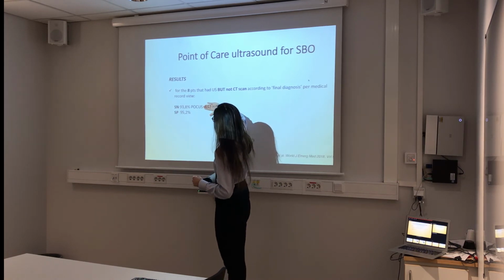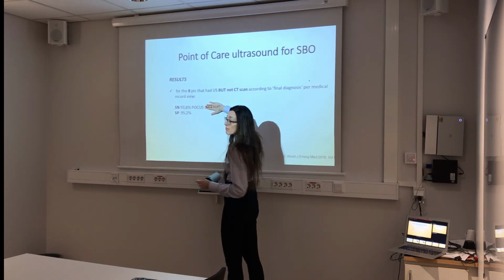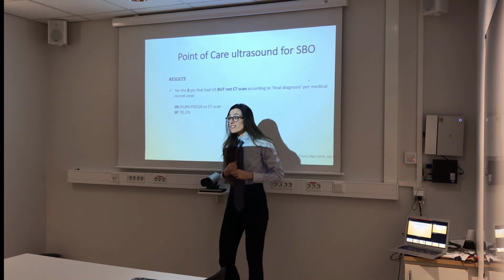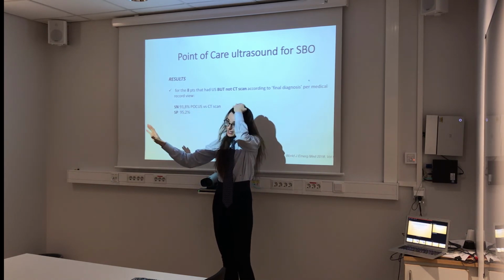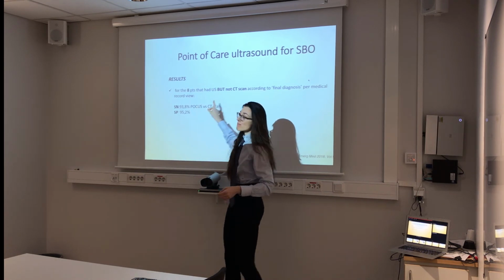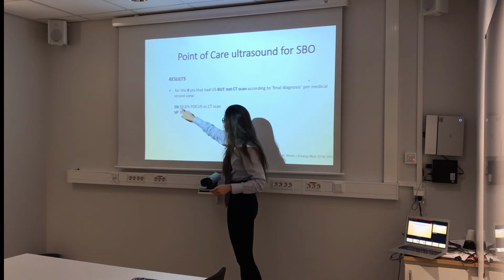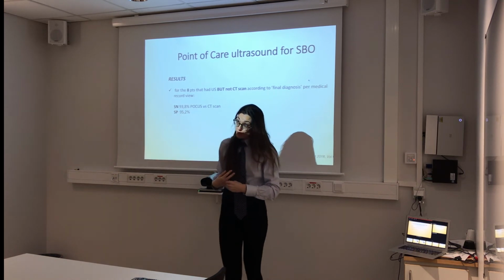This is wrong, it's not versus. The number was almost the same, so they didn't have the CT scan, but for diagnosis, the sensitivity was almost similar, and the specificity was even higher. Did you get it? So the first one, everybody that did point of care ultrasound and CT scan, and the 8 indeterminate. This is the group that didn't get the CT scan from the beginning, but the final diagnosis, say point of care SBO, and then 94 was the sensitivity, and the specificity was 95.